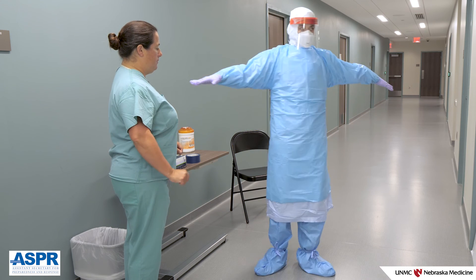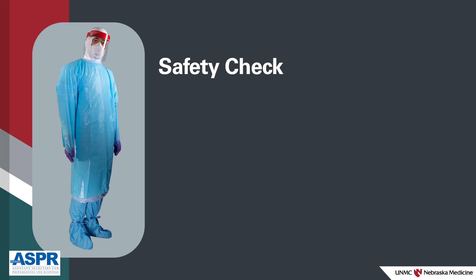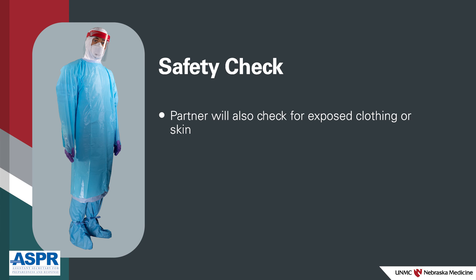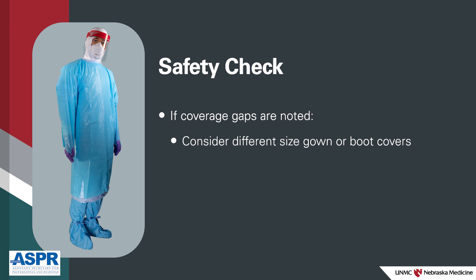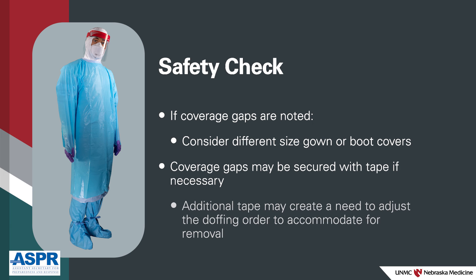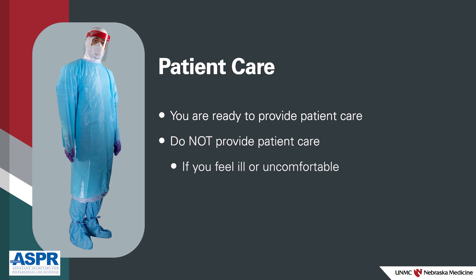At this point, it's important that your donning partner performs a safety and range of motion check to ensure your PPE is donned properly and there are no breaches. Your partner will examine your hood, gown, N95, and boot covers to be sure all seams and ties are intact, and check that no skin or clothing is exposed. The goal is to cover 100% of skin and clothing to mitigate the risk of exposure. Consider selecting a different size gown or boot covers if gaps in coverage are noted. Coverage gaps may be secured with tape if necessary; however, be mindful that additional tape may create a need to adjust the doffing order. Now you are ready to care for the patient. Keep in mind, if you begin to feel ill or uncomfortable, do not go in to care for the patient — instead, get out of the PPE safely.